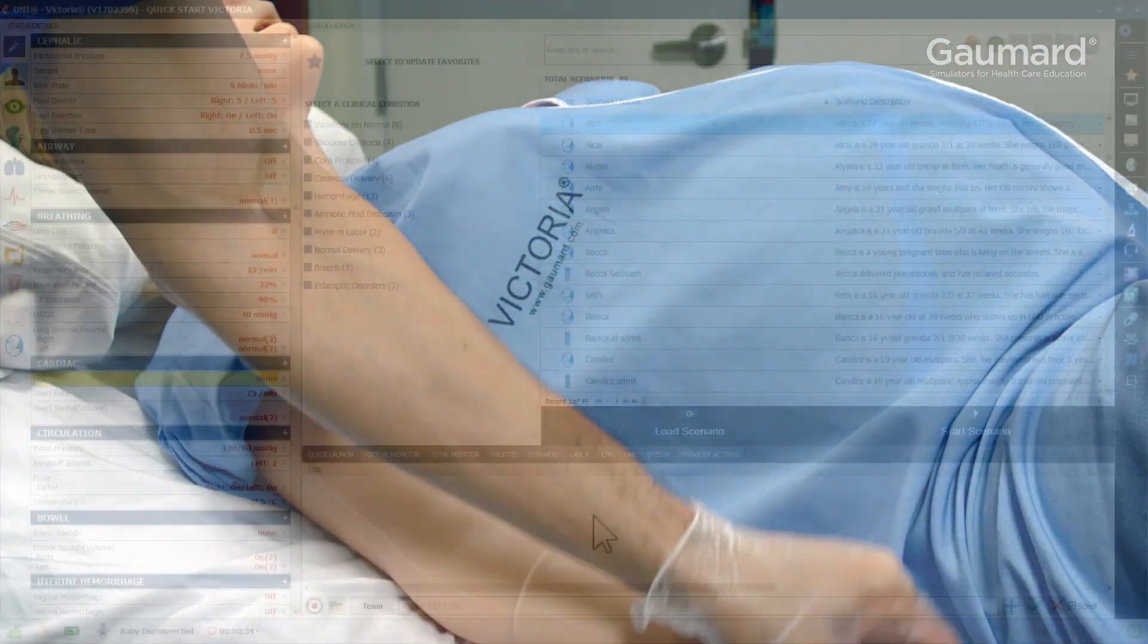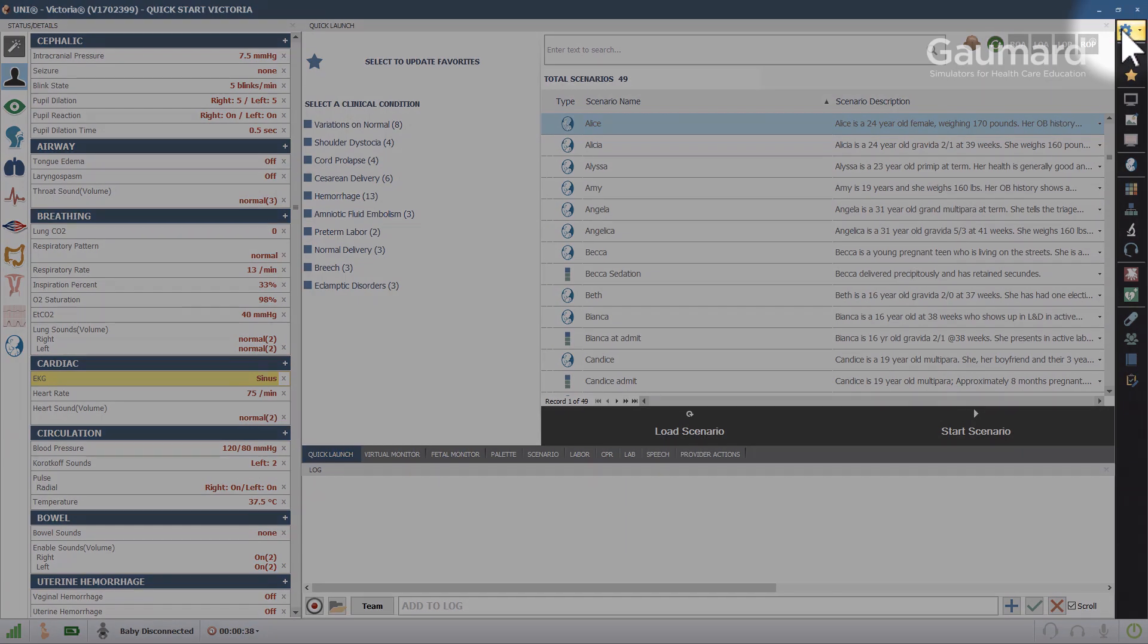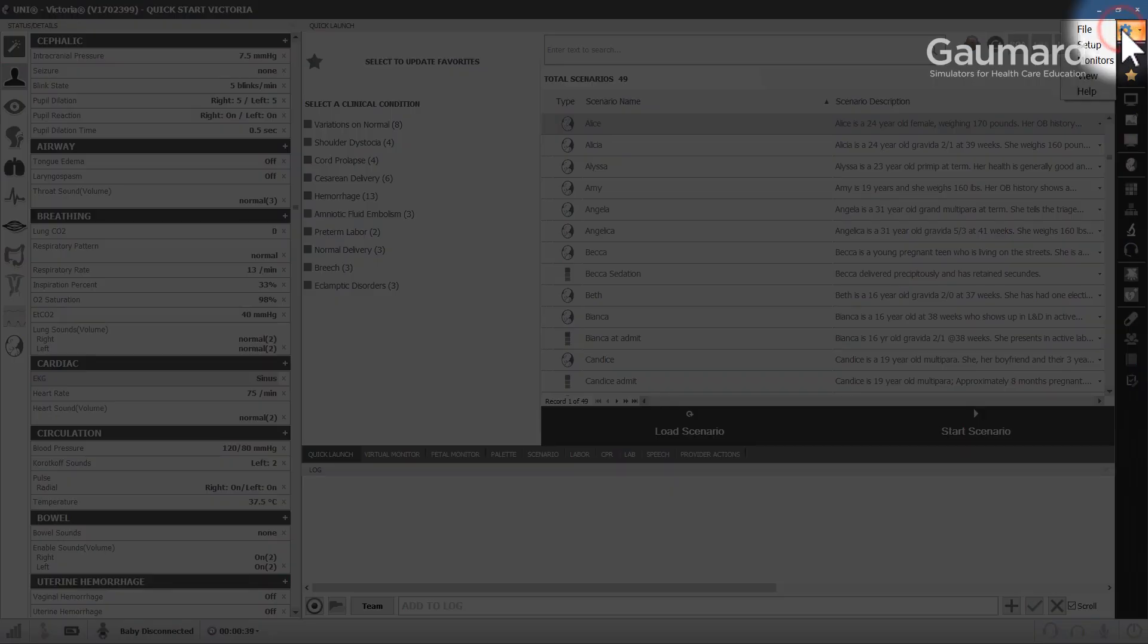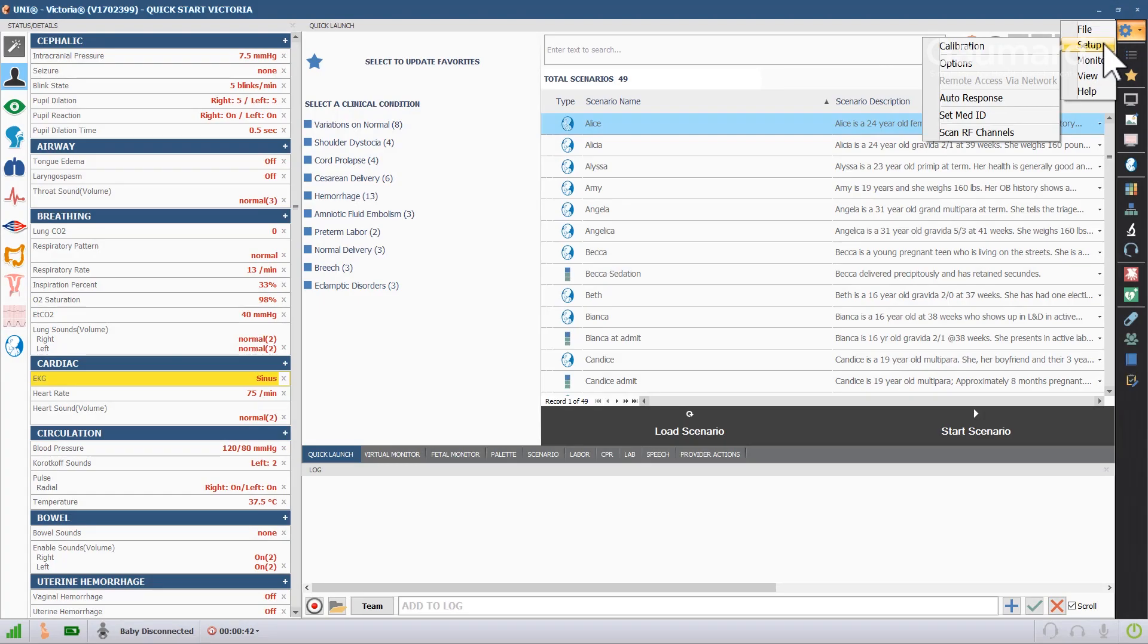The next step in the process is to program medications onto the syringes that will be used during the exercise. Click the menu icon, scroll over Setup, and click Set Med ID.